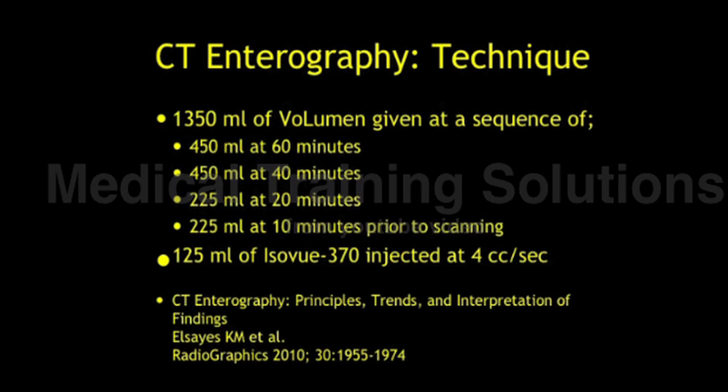I did a survey the other week. Most people are using 3 cups. Some of the newer solutions of volumen tend to have less of the agent that gives patients diarrhea. So it's a little bit easier.